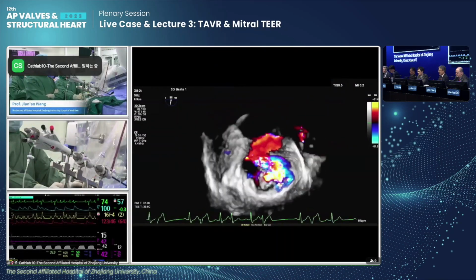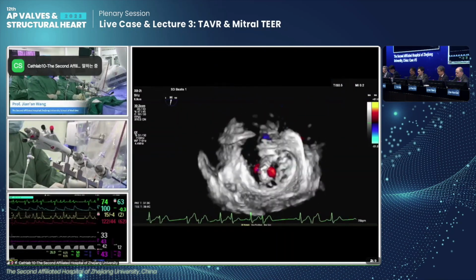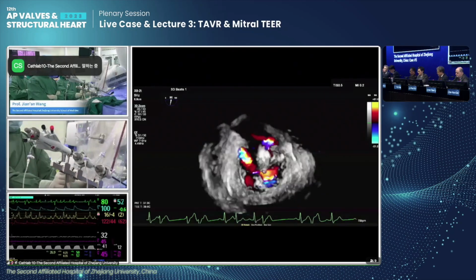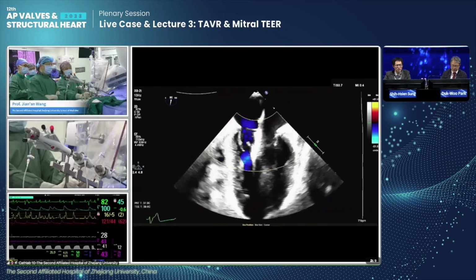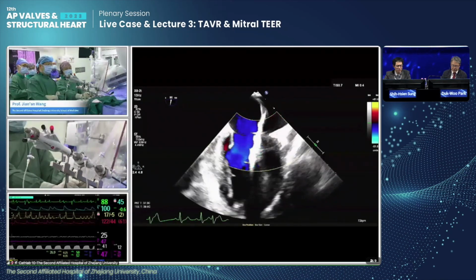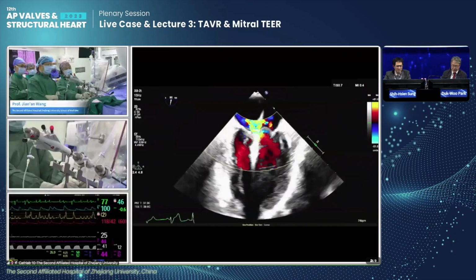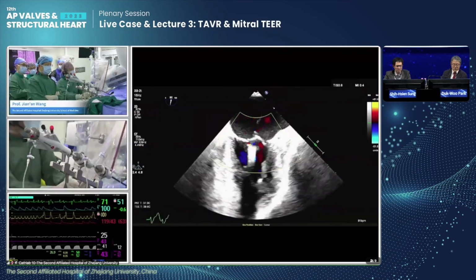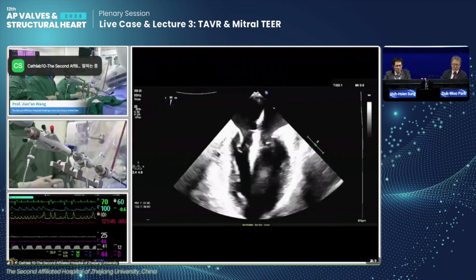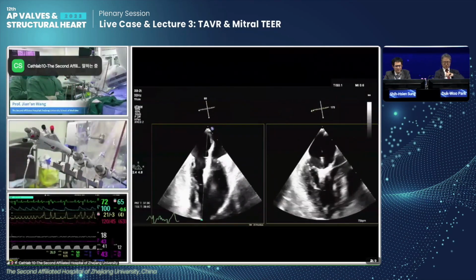可以，应该是往more lateral。我觉得我们需要more medial. No, we can guide by the 2D, the bicommissural. Yeah, the bicommissural can show us the prolapse. So you can use X-plane lateral to the clip. 它叫flail嘛，flail，不要把它漏掉。Turn the camera off. Prolapse.